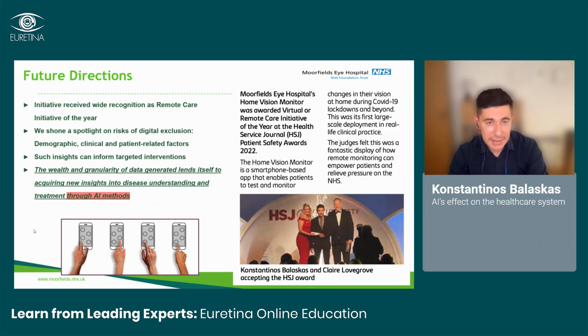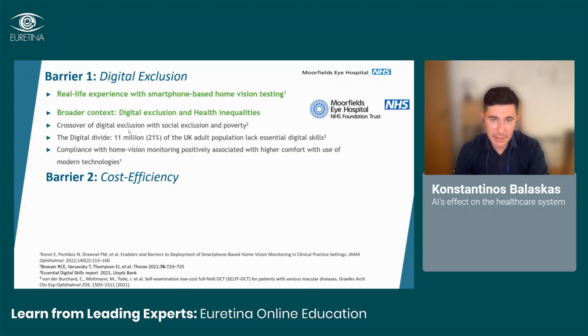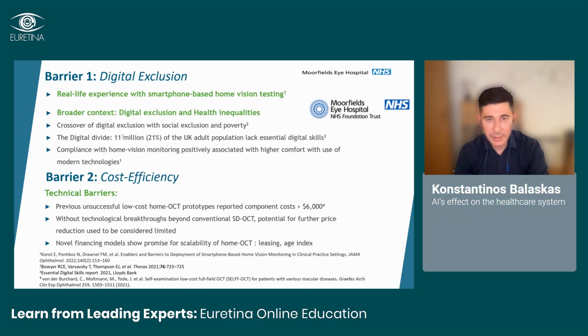Another important point is that both home vision monitoring and home OCT will generate a wealth of granular data. Patients may be testing every day. And that is where, again, AI can shine in making use of this data and help us gain greater insight into the natural history of these conditions, their behavior, and their likelihood for response to treatment.